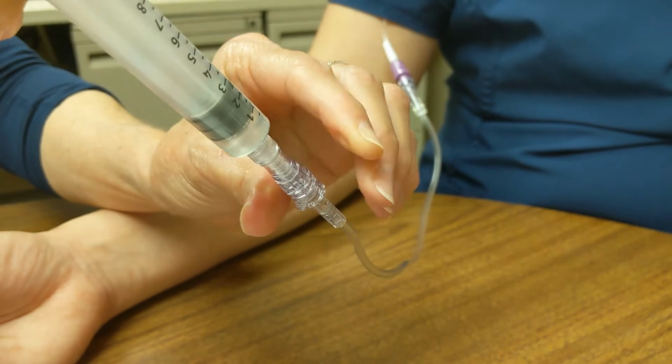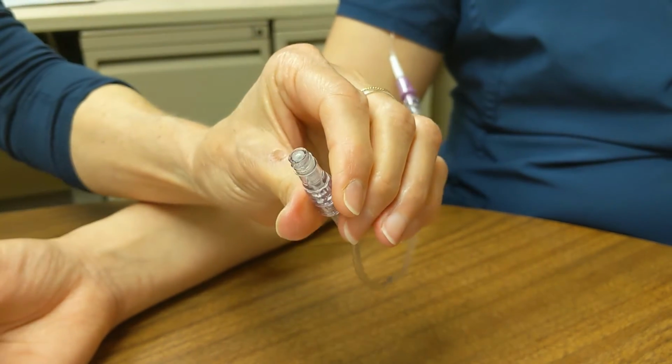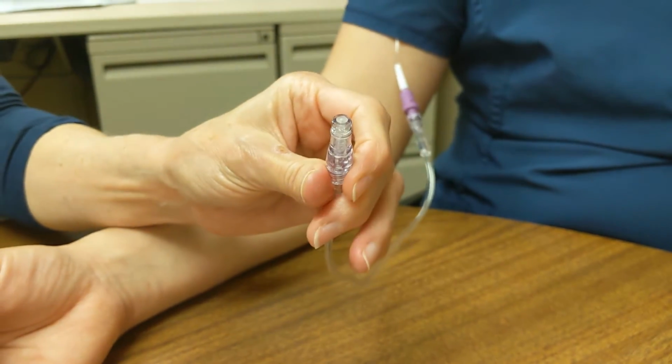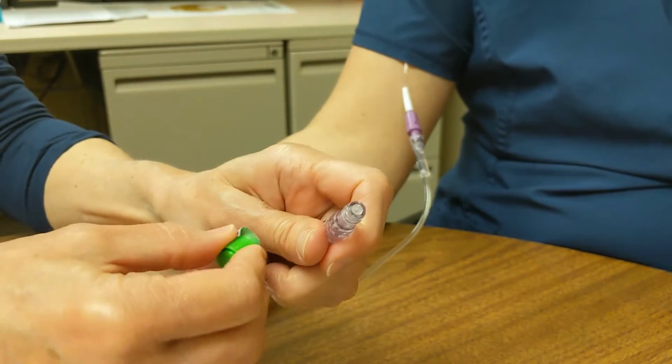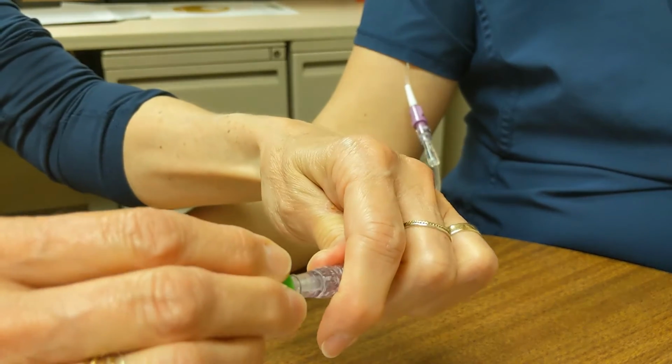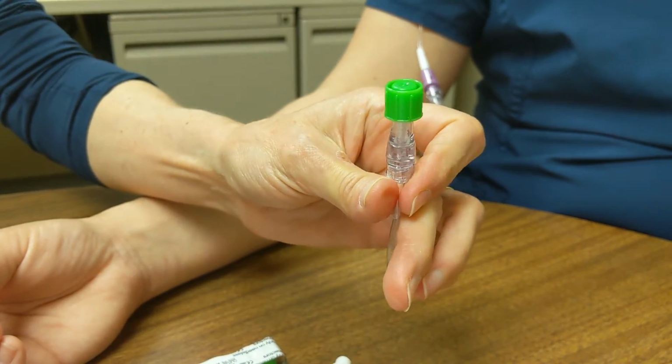Holding on to the ridged edge of the clave connector, remove the syringe with a slight twisting motion. Lastly, apply the green cap to the clave connector. You do not need to clean with an alcohol swab prior to this step, as the green cap contains alcohol.